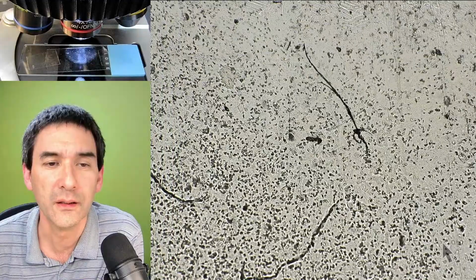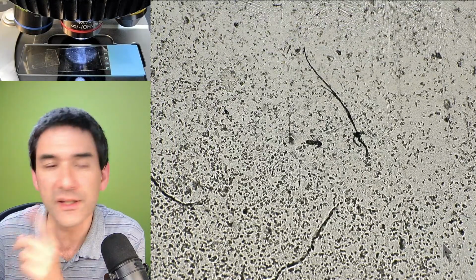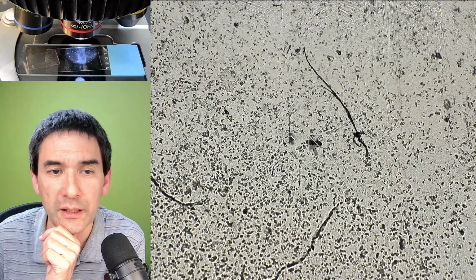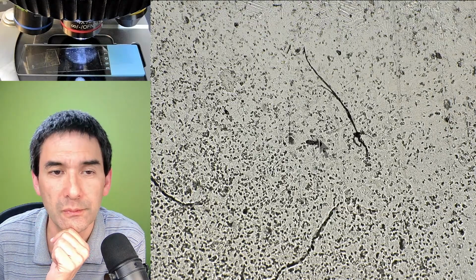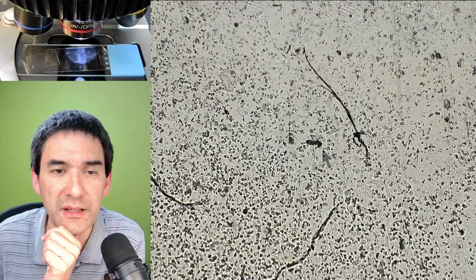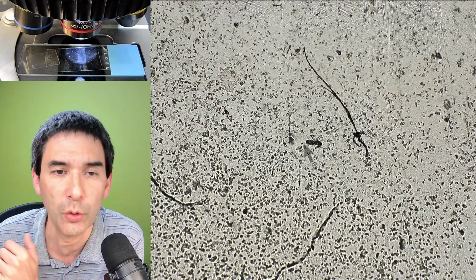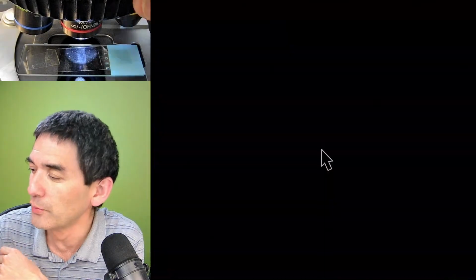Okay, yeah. So have a close look. Are you able to see it already? That's now just as a reference, using my 4 times low power objective. Okay, this one over here, that's a face mite. It can be overlooked quite easily, but you see, even at low power you can actually see that there is something there. You have to zoom in.